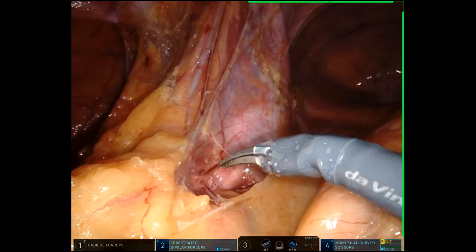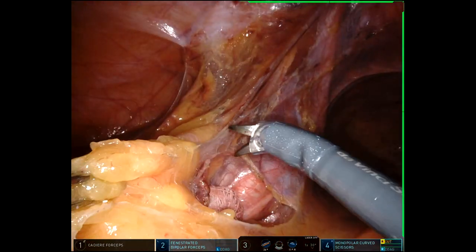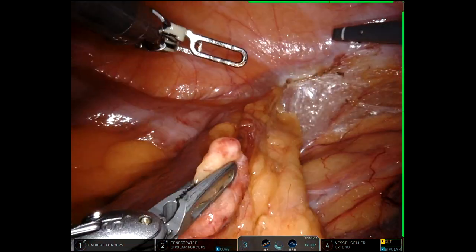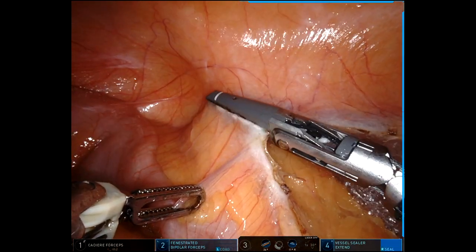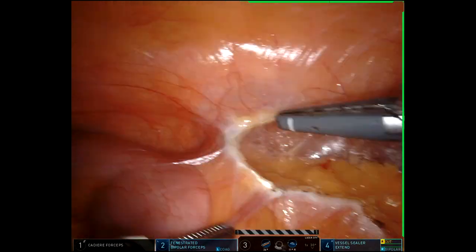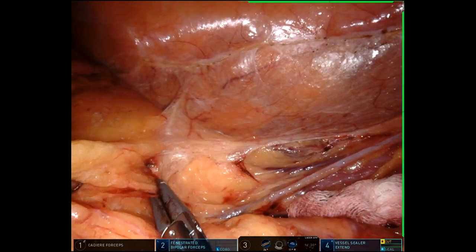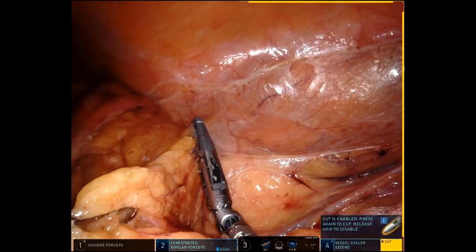Right there — and you see how that sponge being a marker over the ureter helps protect you. I don't tend to use ureteral stents for patients without diverticulitis in primary surgeries, unless there's something on the CAT scan that shows me either a tumor or otherwise near a ureter. Now I'm just doing some lateral mobilization. I find you can do this very quickly with a vessel sealer compared to scissors — getting right in the plane along Toldt's fascia, a couple of spreads, and then burn.